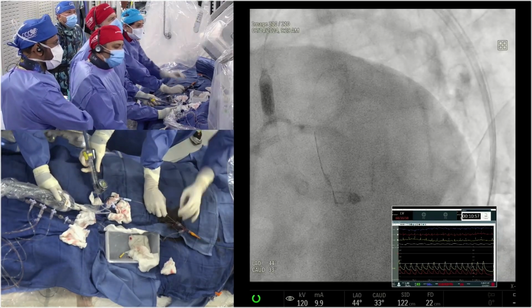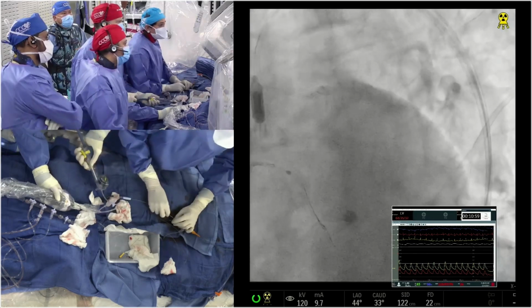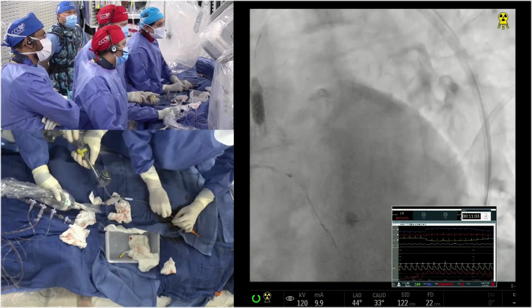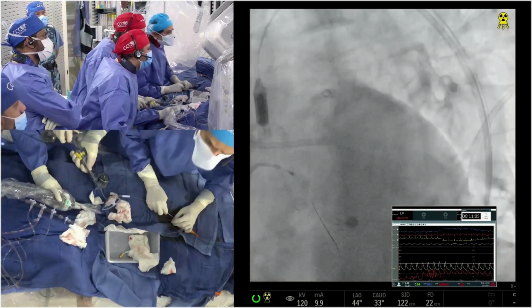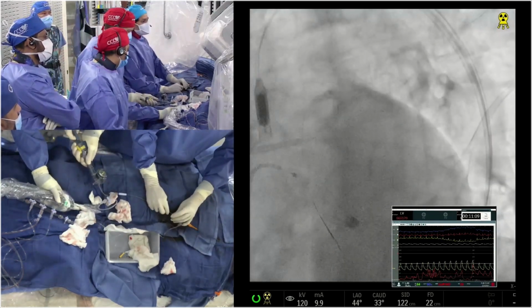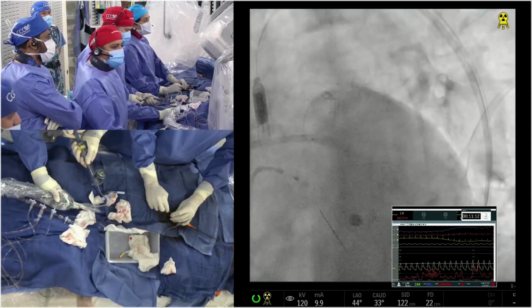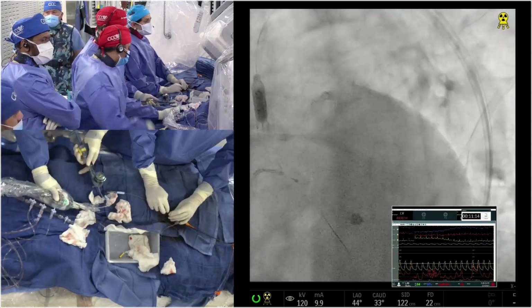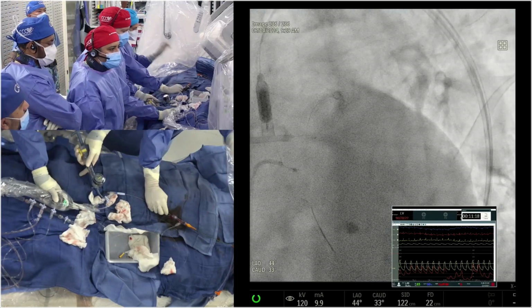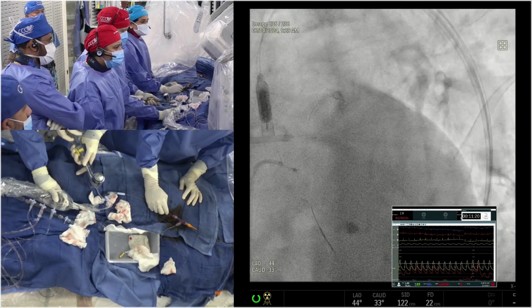But look at this, Roxana. Look at the blood pressure. Yes, we see it. Thank you. Let's look at it. Yes. So 2, and I think we did agree. I'm changing it. Going back a little bit inside. Okay, good. One more, and then I think quick IVUS. We can see what the IVL did there. What size is that? We still see the blood pressure hasn't really recovered yet. You give it a little more chance.